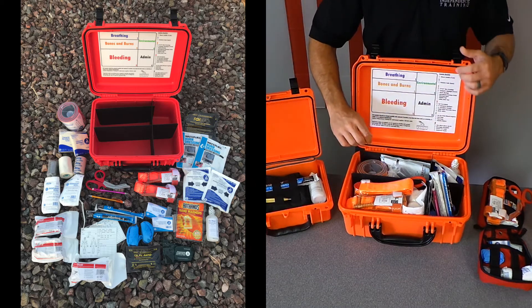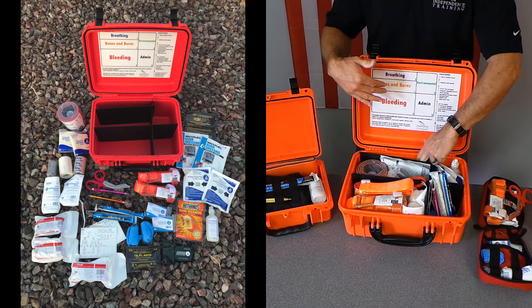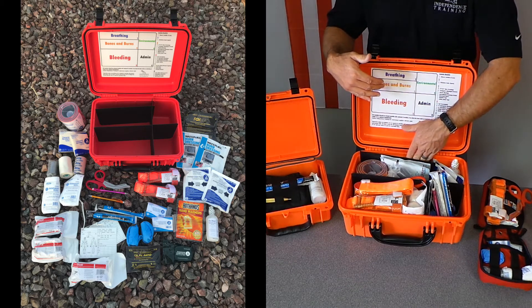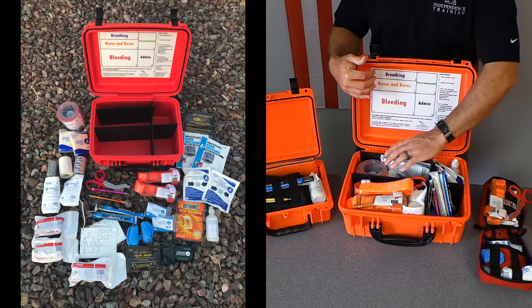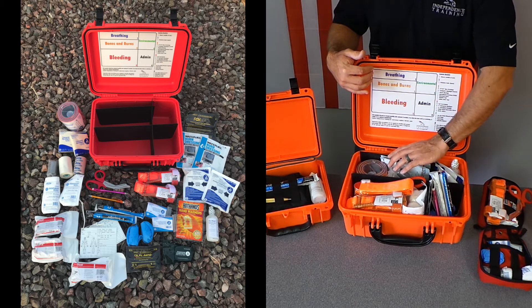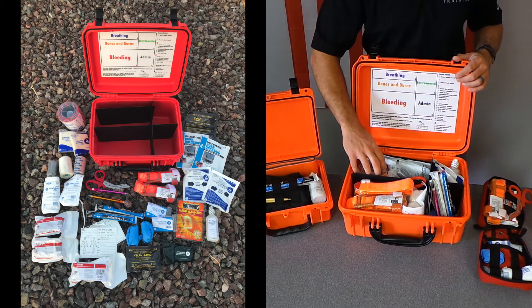So we've broken it into five different sections. The breathing section — in this case we only put occlusive seals in there, but we've left plenty of space to either add more occlusive seals, NPAs, decompression needles, or even cricothyroidotomy kits based on your own skills, training, and particular situations.